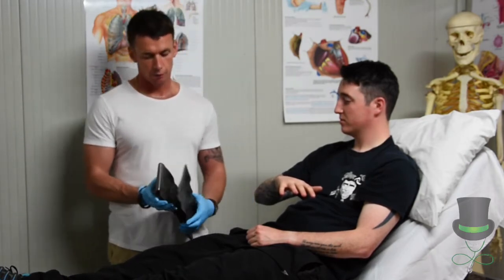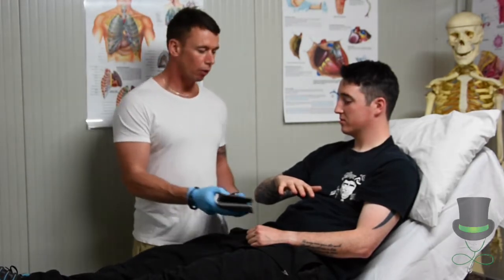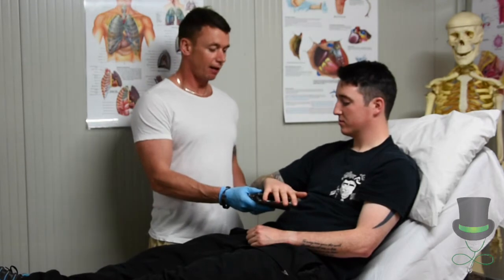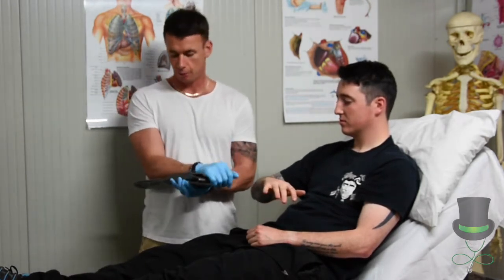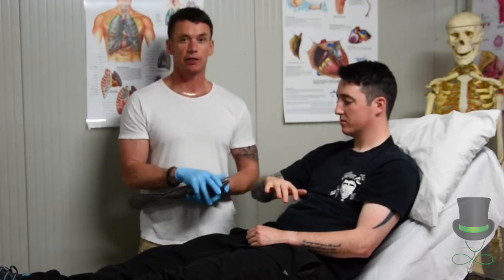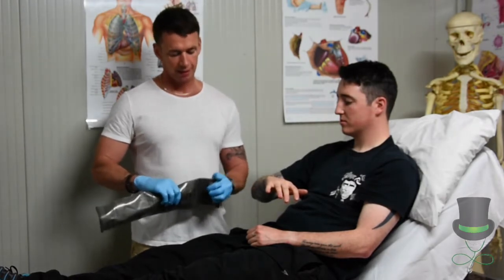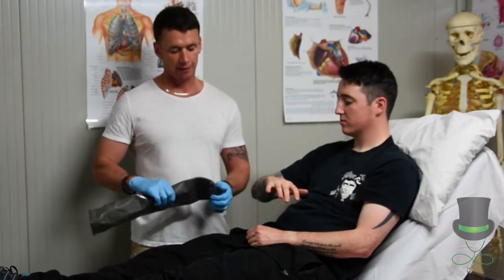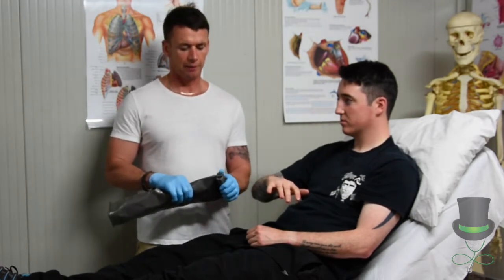Now we're going to apply a SAM splint. Remove the SAM splint from its packaging, and then we want to mold it to the shape of the arm. We can mold this on our own arm first to prevent causing any pain to the patient as we do it. We can make a twist at the bottom of the SAM splint like so, so the patient can grip this.